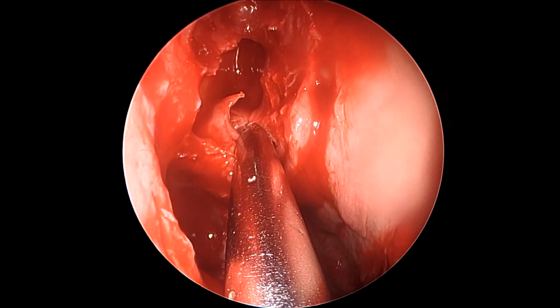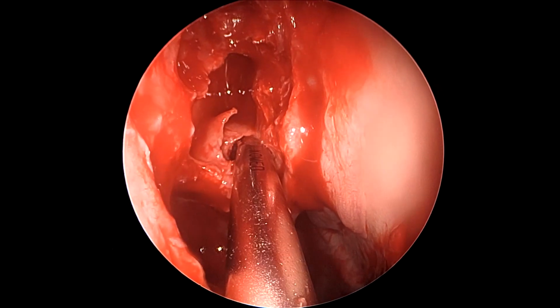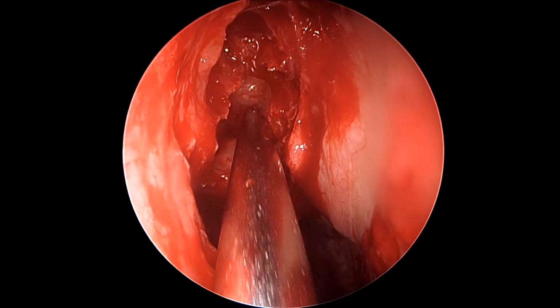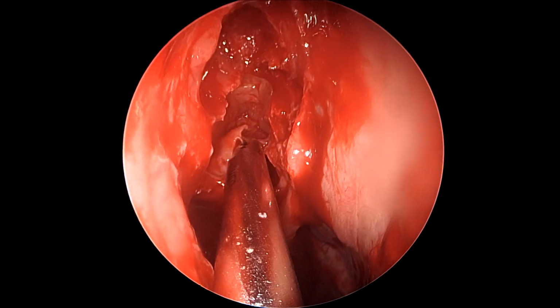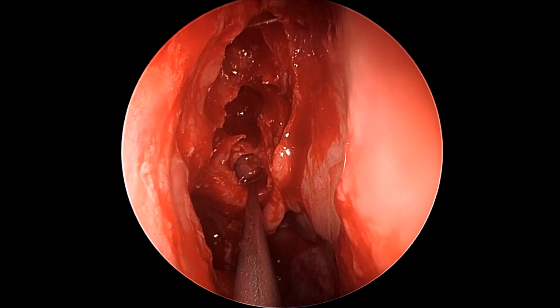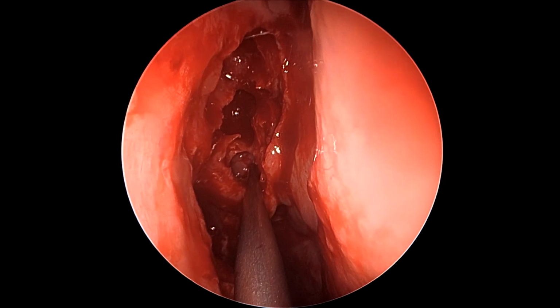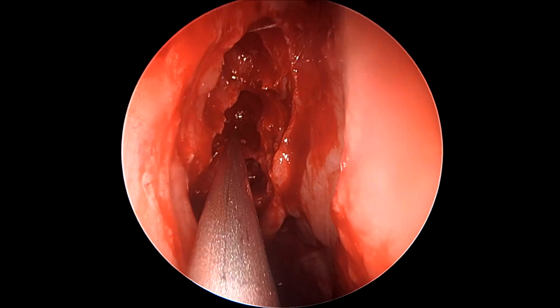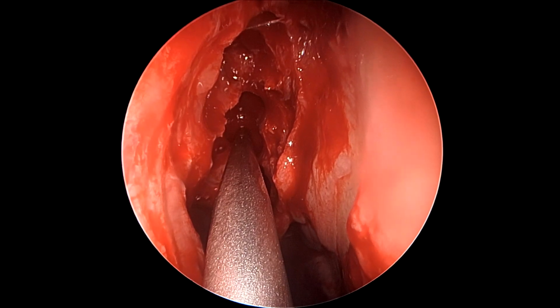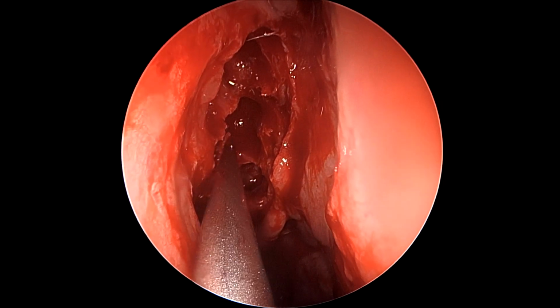The transitional antrostomy ridge, however, guides our way into the posterior ethmoids, which is the antrostomy ridge between the horizontal and the vertical ones. And following the transitional antrostomy ridge, slightly medial and slightly superior to it, we fracture the basal lamella to enter the posterior ethmoidal cavity. As we see here, we are again using the navigator probe at the same level as the horizontal antrostomy ridge to locate the approximate entry into the sphenoid sinus. And this is the posterior ethmoidal skull base as pointed here.